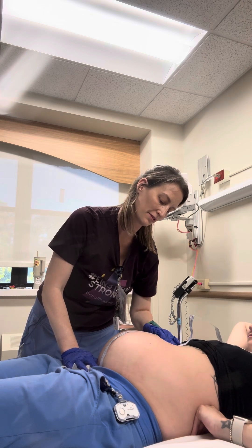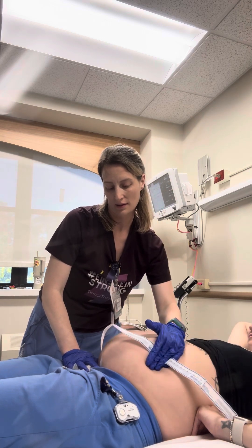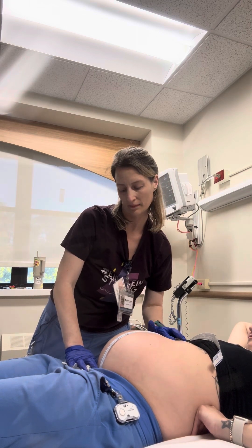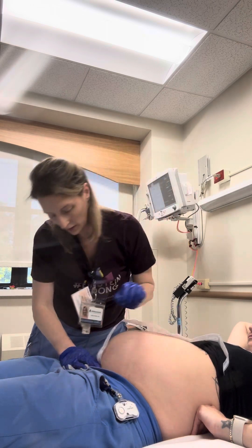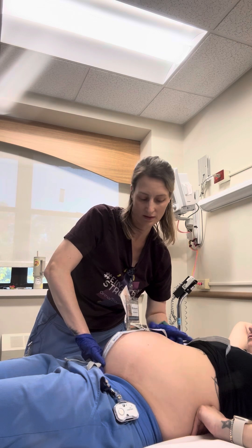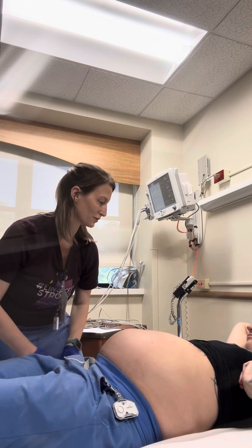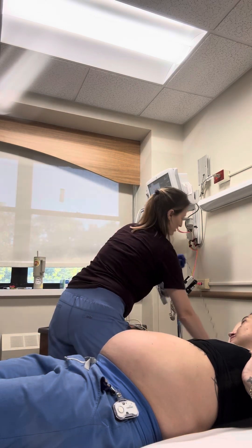At 35 weeks, you should be measuring pretty close to that. I have you measuring right at 35 centimeters, so that is perfect. That has been going along with your history since you were last measuring around 34 to 35. Now we're going to check your fetal heart tones.